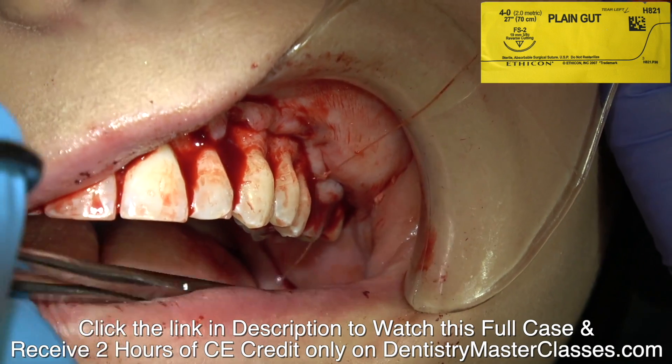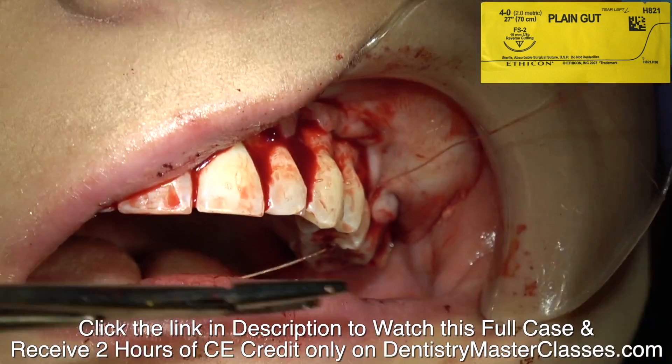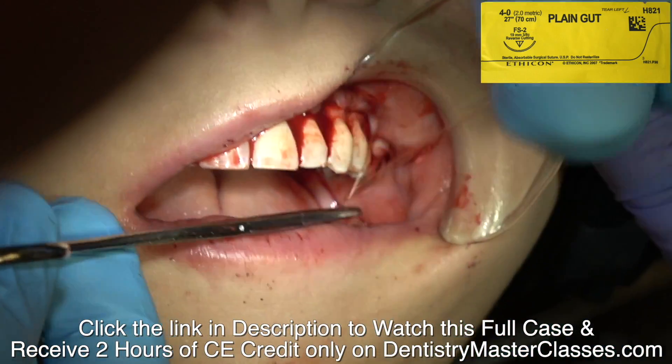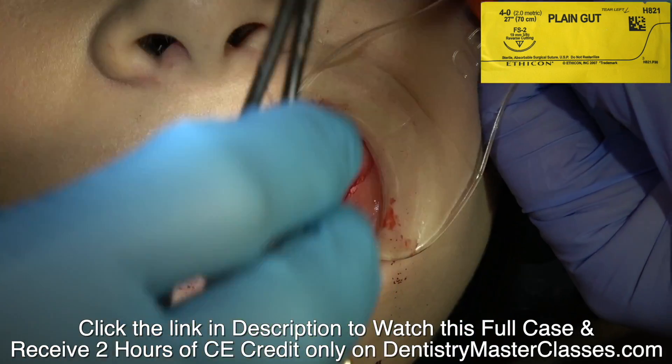I do two or three wraps away, then a wrap toward me, then a wrap away — so one, two, or one, two, three away, one toward me and another one away.